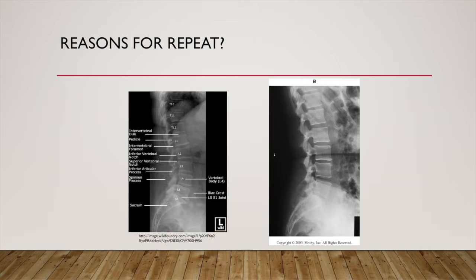Lateral lumbar spine radiographs can be repeated often due to image processing errors. Since the lateral projection requires the X-rays to go through more density of soft tissue, it is likely to have a grayer image with decreased contrast. For example, you might want to decrease kVp and increase mAs to improve image contrast. However, if you have more soft tissue to penetrate, you cannot decrease kVp too much, so you must be efficient in setting the appropriate exposure technique for lateral L-spine radiographs. This is another reason why placing a lead shield behind the patient's back could help with reducing the amount of scatter on an image.